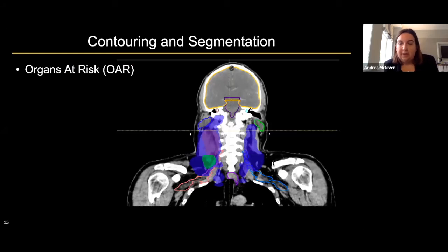So now in these next few images, I have those targets in a color wash, overlaying where we want to deliver clinical dose to achieve control.